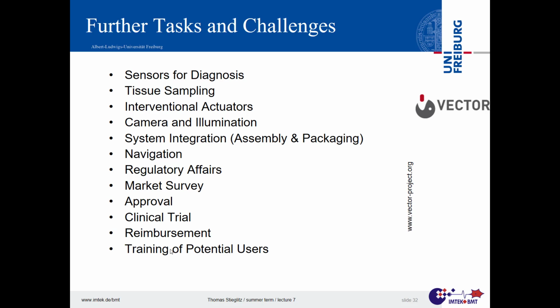And please do not forget the users. That's very important. Users are adapted, as you get an education, other users get other educations, and they're trained in that. And if you're trained in a certain way, you cannot imagine that some new devices don't survive your handling. And this is very important.